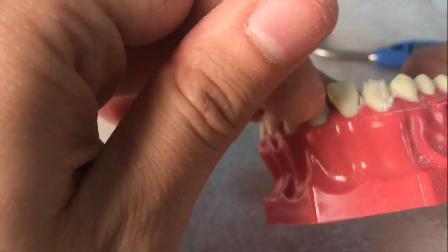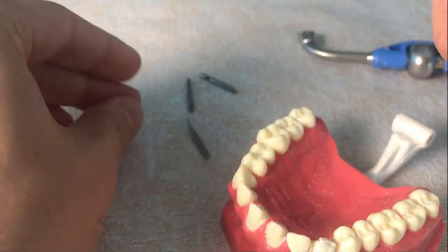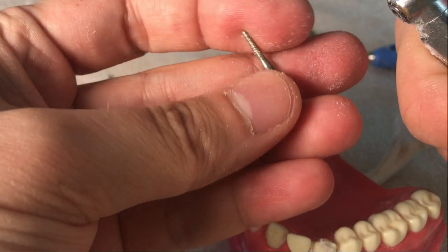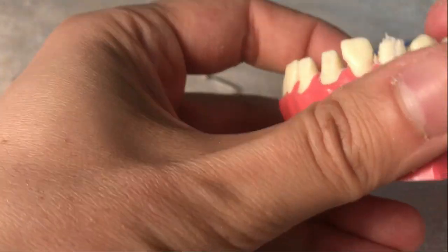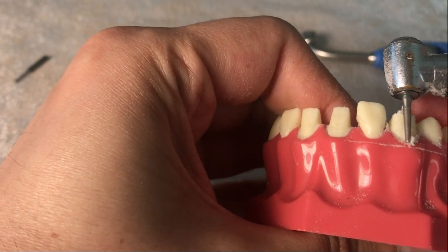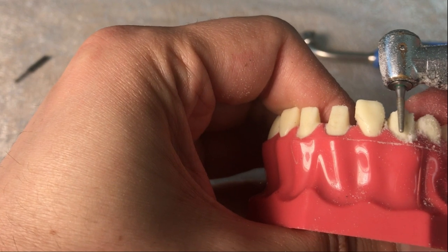When I think I made enough preparation on the axial walls, I remove the flame end burr and insert the tapered burr. I place the tapered burr parallel to the long axis of the tooth and continue the preparation on the buccal and the proximal areas in order to form the taper.